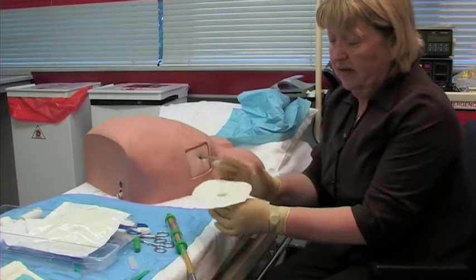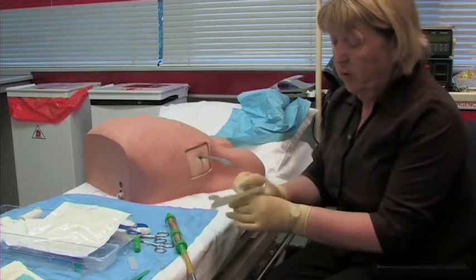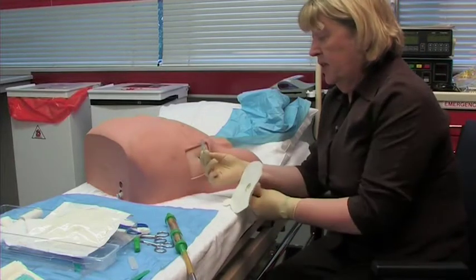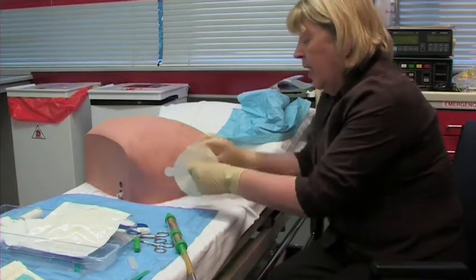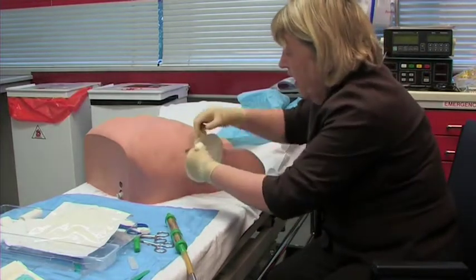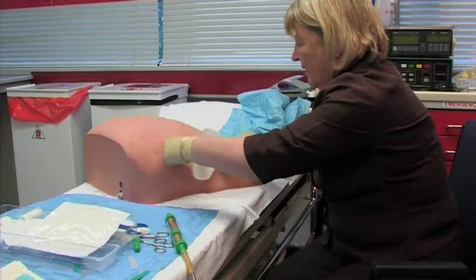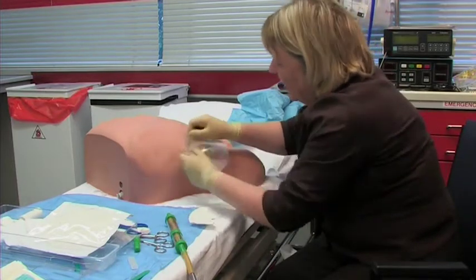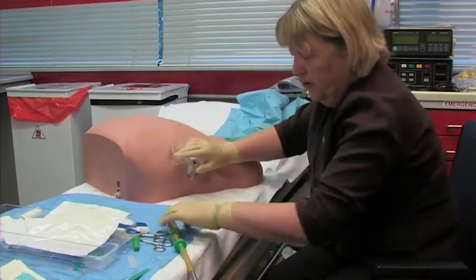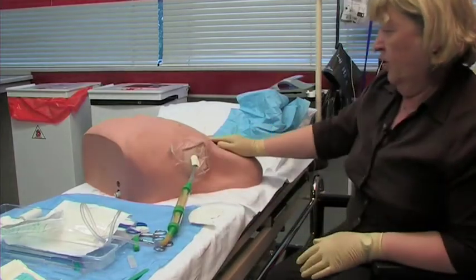The Asherman chest seal is essentially designed for treatment of a sucking chest wound. It has a one-way valve that allows air to escape. Take the end of the chest drain and with a bit of pressure, push through. Then remove the backing and attach it to the chest wall, giving you a very good strong seal, and then just attach the bag as normal.